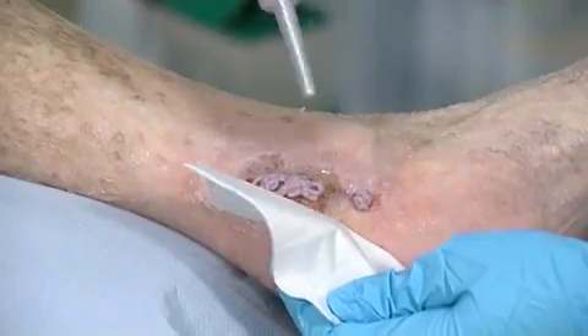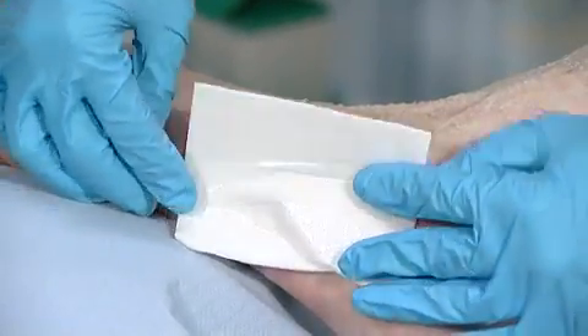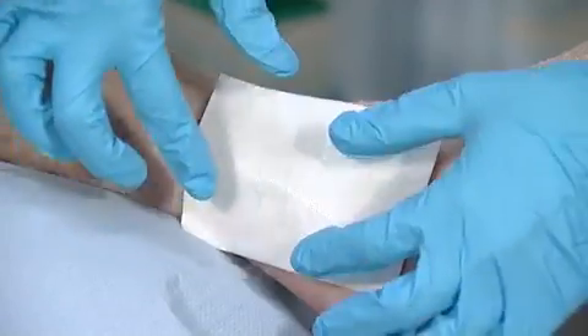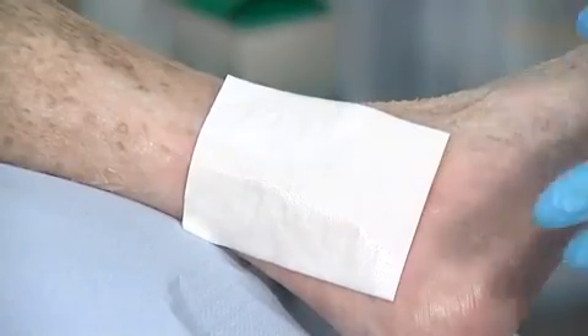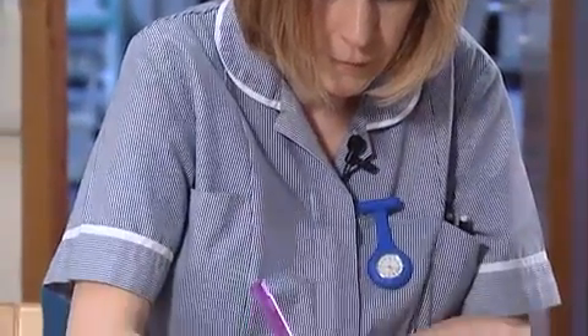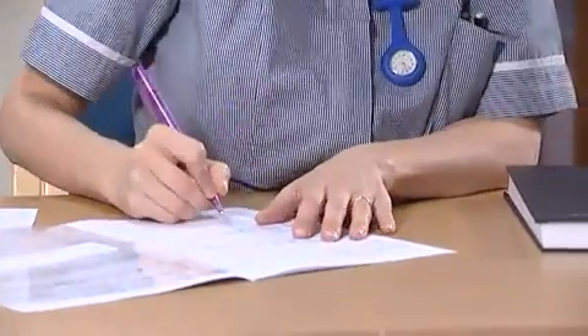A suitable secondary dressing is then applied over the paste and left in place for a maximum of three days, when it can be simply rinsed from the wound using a cleansing solution to remove any residue. It's important to reassess the wound at each dressing change and evaluate the appropriateness of the current treatment plan.